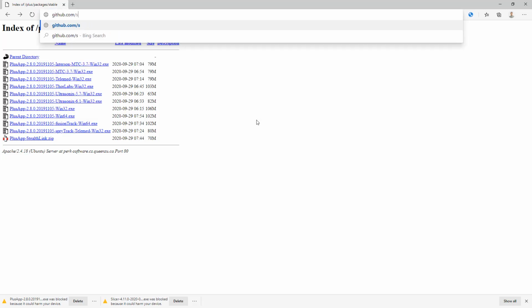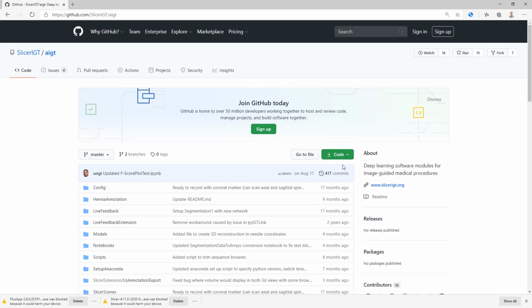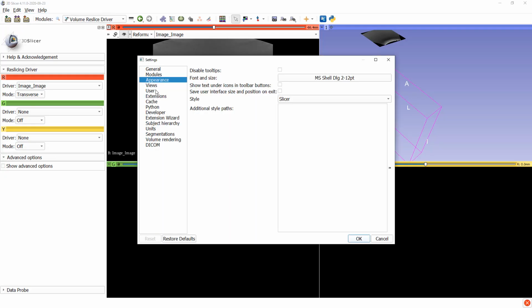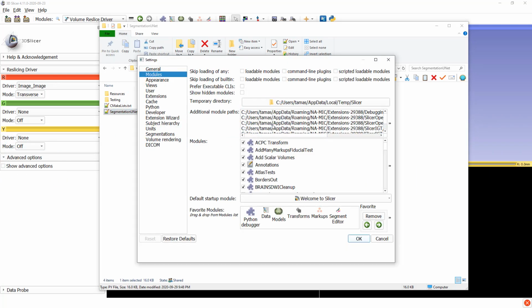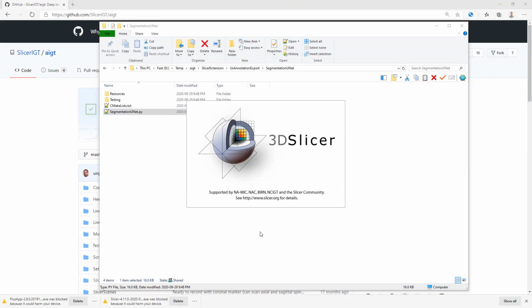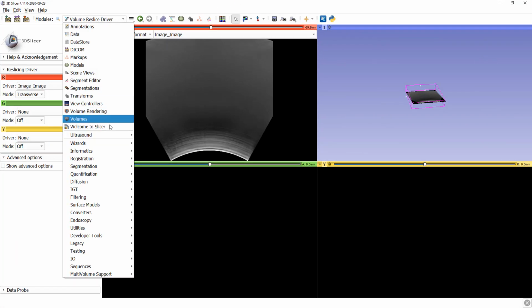So the next thing that we need is the AI component. If we go to the SlicerIGT GitHub repositories, then AIGT is the one for the AI models. You can clone it on your computers. It's open source. And then add the Slicer module Python files to the additional module paths in Slicer. So this is how we can add a custom module to 3D Slicer. After a module has been added, Slicer needs to be restarted. If you don't have TensorFlow installed in the Python environment of 3D Slicer, you also have to do that for this to run on your computer.